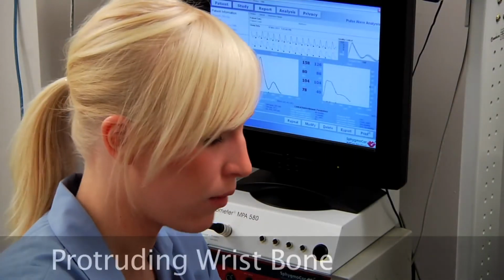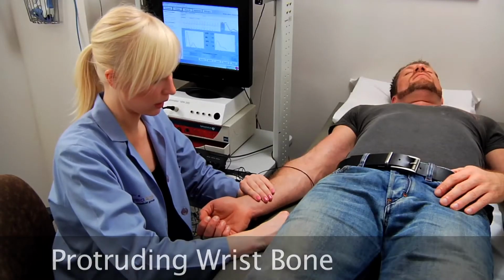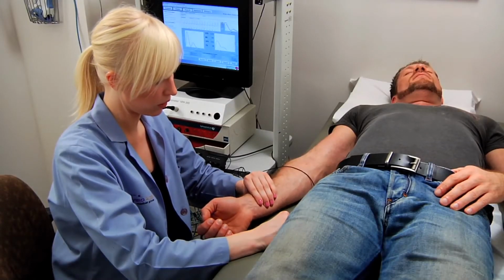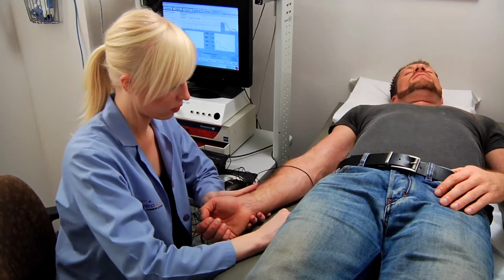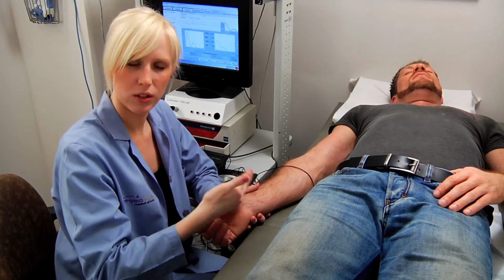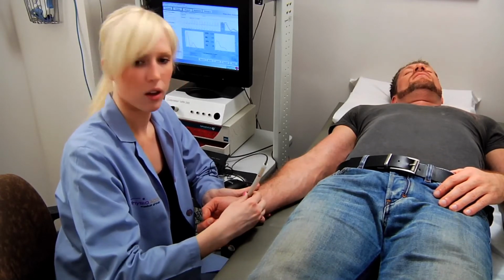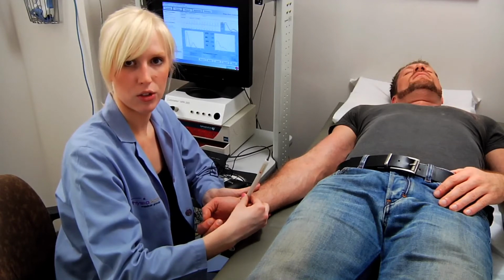It's mostly women who have a protruding wrist bone right here. If you really can't get the measurement, just gently turn it in a little bit, hold the wrist, and what that did is that let the artery fall just a little bit, just enough away from that wrist bone, and now you'll be able to place this on the wrist and get a measurement.